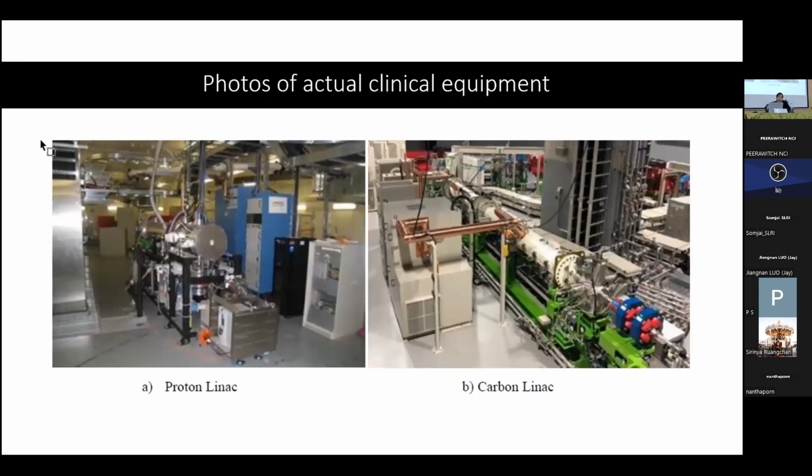Here's just a picture of one installed. The one on the left is a proton LINAC. The one on the right is a carbon LINAC. And so these are not necessarily small things. These are fairly long, kind of massive devices, with all their power supplies, etc.